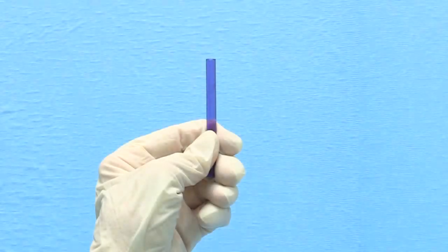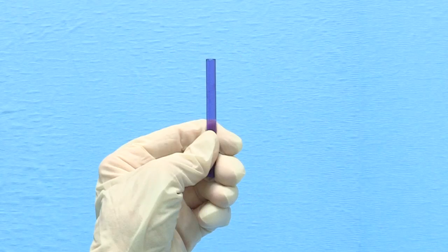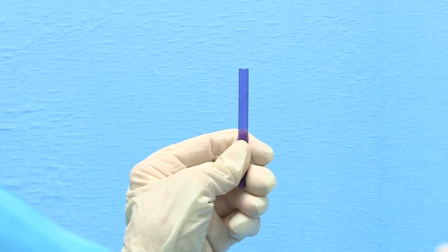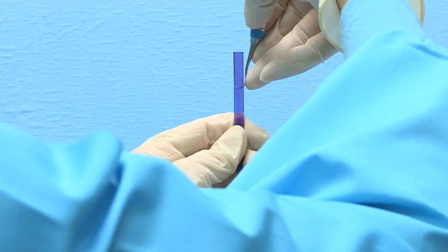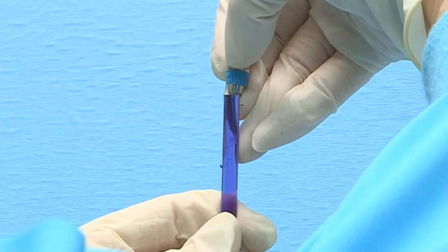To test the cutting edge with a plastic test stick, hold the test stick in your non-dominant hand between your thumb and index finger near the bottom of the stick. The position for the plastic test stick is 12 o'clock. Hold the instrument in your dominant hand with a modified pen grasp. Place your fulcrum on the right side of the test stick. Bring the instrument around the back of the test stick with the tip pointed toward you. Place the cutting edge to be tested against the left side of the test stick, opposite your fulcrum.